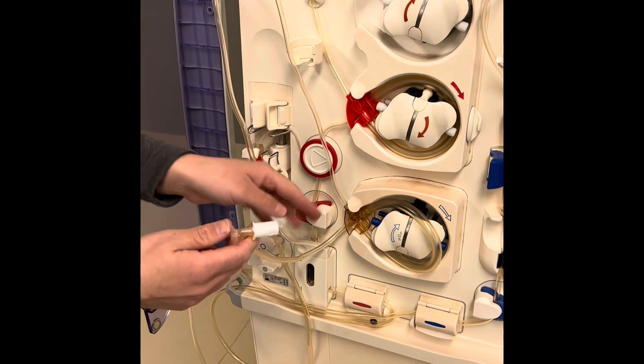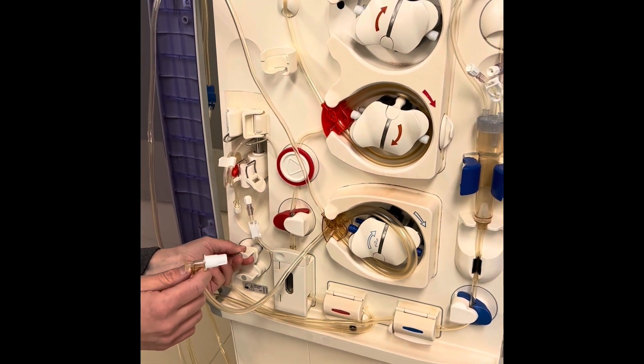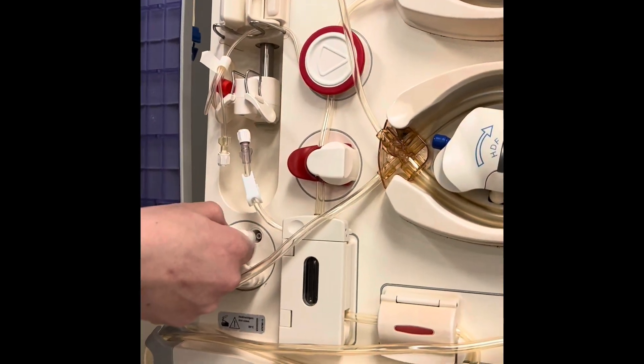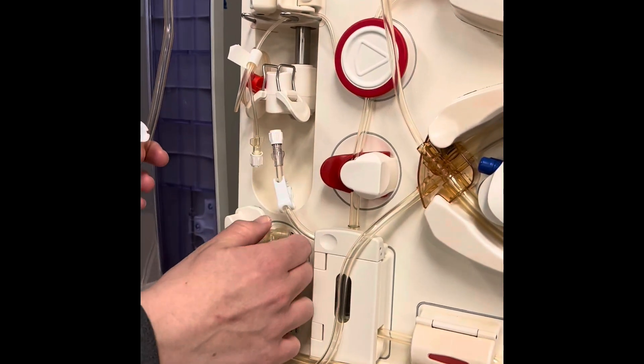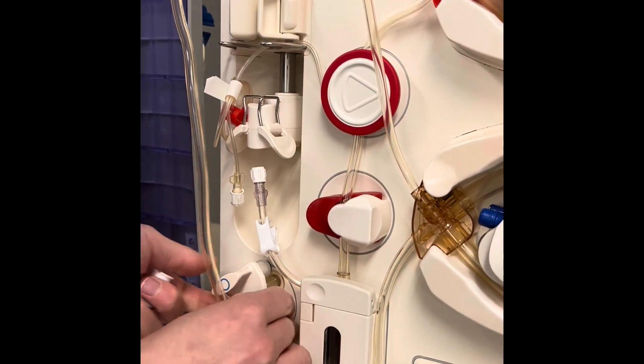Here, if you can see, this is your substitute port. I'm going to open this up — you have to pull outwards and pull up. I'm going to remove the cap here, and it's going to attach here like a little door.